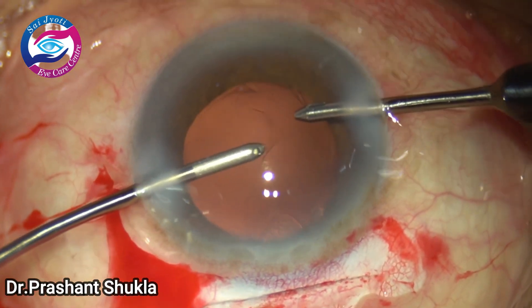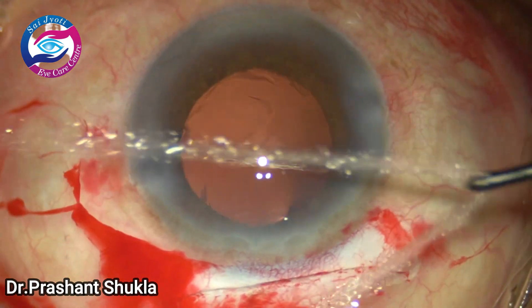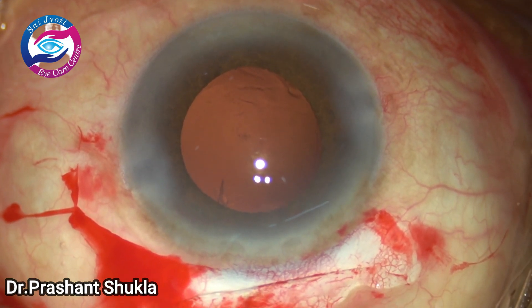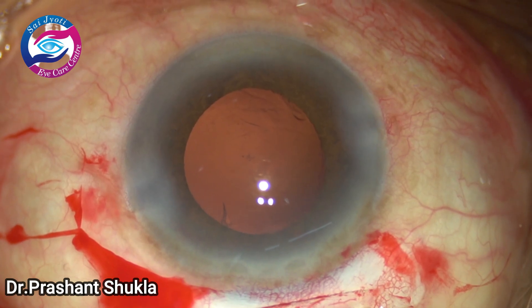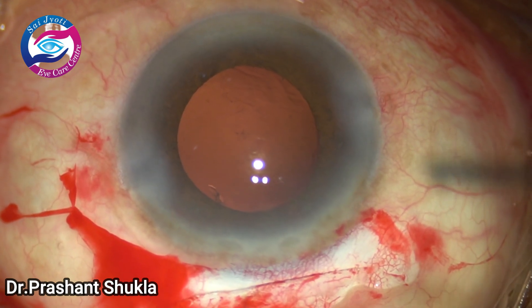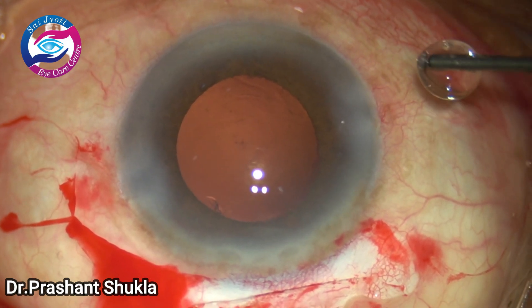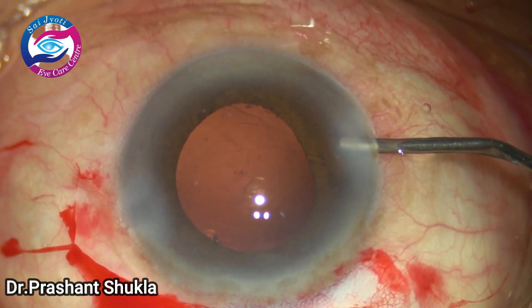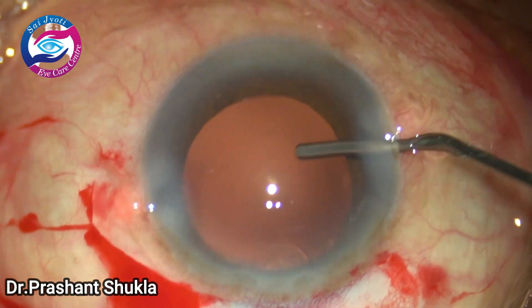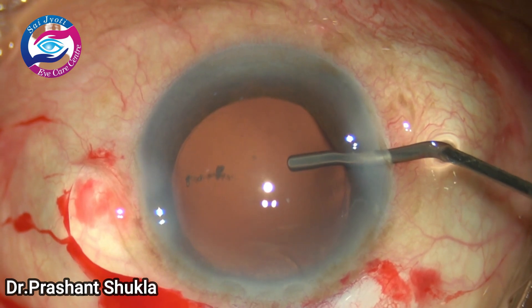I purposely uploaded this film because I also had issues with dialing of the intraocular lens in this case. The cortex has been removed and the anterior chamber is filled with 2% HPMC. The capsular bag is also filled with HPMC to create space for intraocular lens implantation.